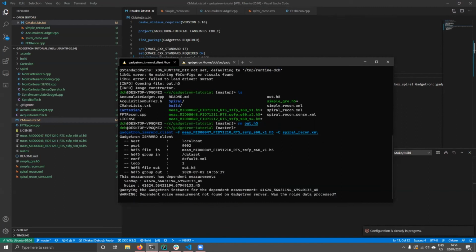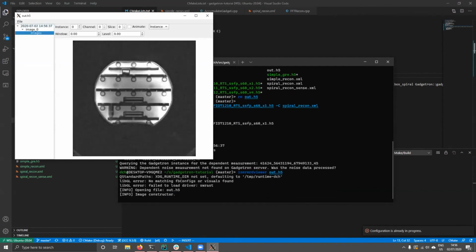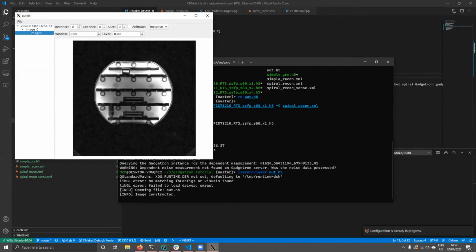It will take a little bit of time. This is a sort of large data set, like 460 megabytes, but still not too shabby. Let's have a look. Oh, it's a phantom. Hooray! And you can see we're doing gridding. It is a little bit blurry, as gridding often is, but still pretty decent, if I say so.